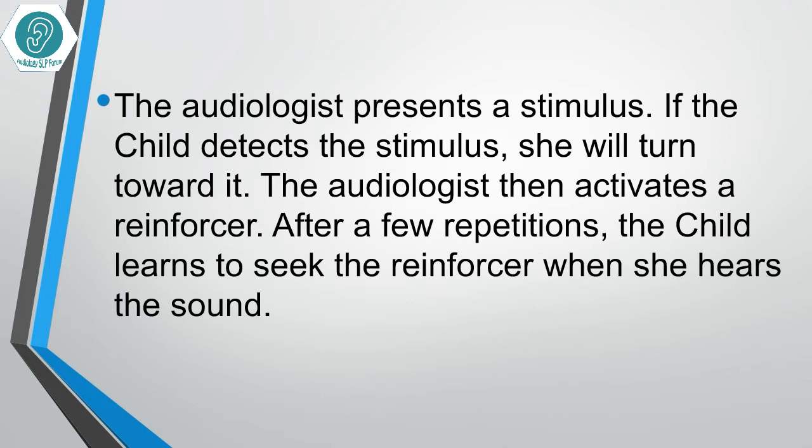The audiologist presents a stimulus. If the child detects the stimulus, she will turn toward it. The audiologist then activates a reinforcer. After a few repetitions, the child learns to seek the reinforcer when she hears the sound.